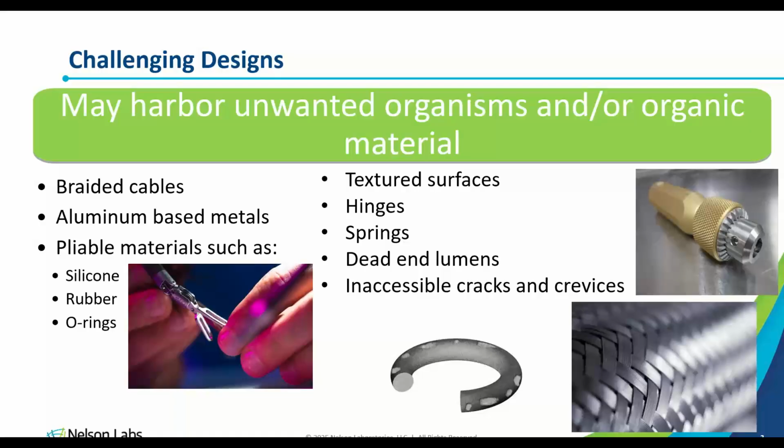What you don't want to do is get to the very end. You've designed your device, you've done human factors testing on it to make sure that it's usable, and then you do your reprocessing validations, and you find that it's quite difficult to clean and/or disinfect or sterilize.